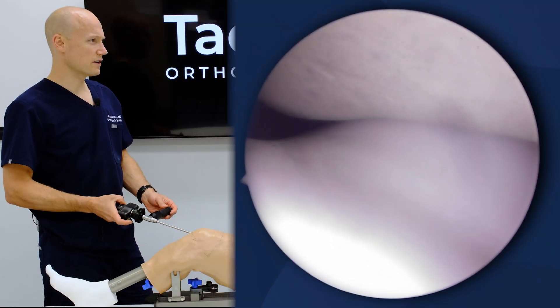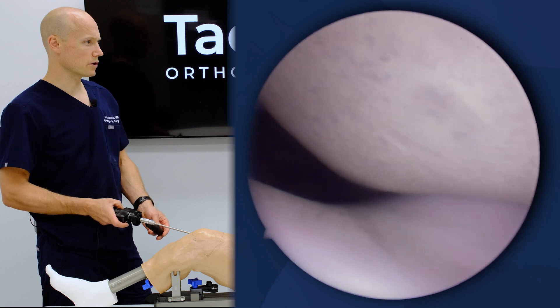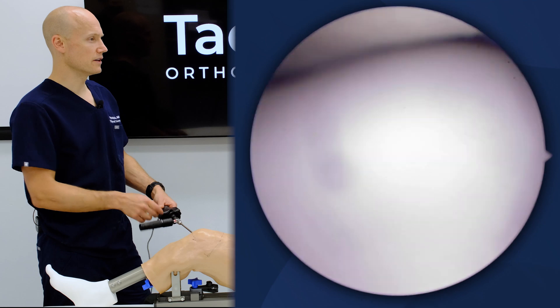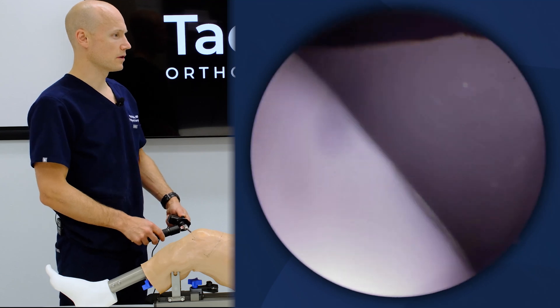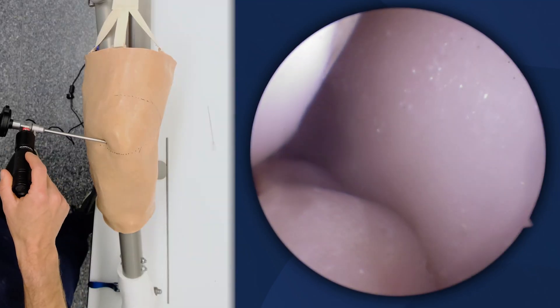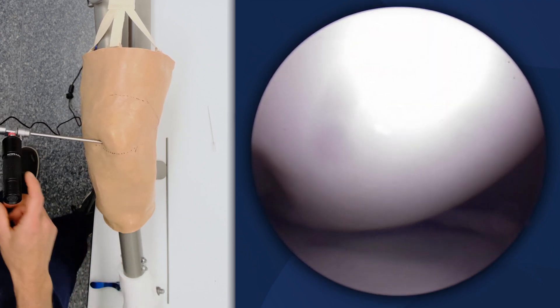You can see along here the patellar position relative to the trochlea. We're looking up at the lateral patellar facet. I can go along and see the trochlea, come along and look at the medial patellar facet. I can come along and stay within the medial compartment, seeing the medial meniscus and coming down in the medial tibial plateau articulation.